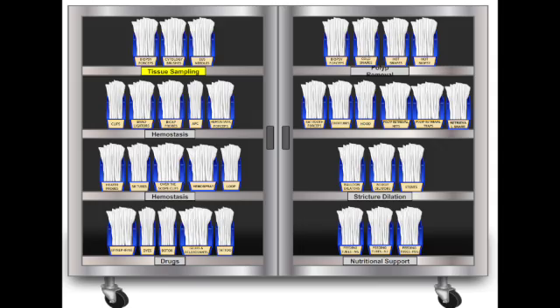Okay, so when is it epinephrine? If it's bleeding from an artery, or ulcer bleeding, a Mallory-Weiss tear, a Dieulafoy lesion, bleeding after a polypectomy, even some diverticular bleeding, in those cases, yes, epinephrine. It causes vasoconstriction, clamps down the vessels, stops the flow. But what if it's not an artery, like veins, varices? Exactly.